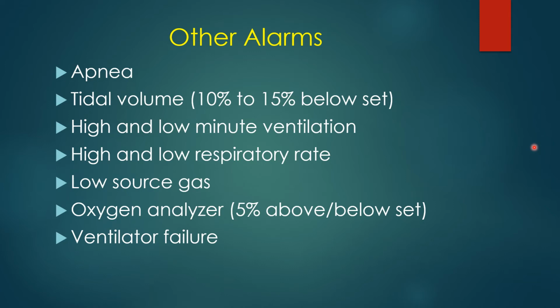The ventilators have an oxygen analyzer built in. The old ventilators didn't; you had to attach an oxygen analyzer. And the built-in oxygen analyzers tell you with an alarm if the analyzed O2 is off by 5%, above or below. And these ventilators today are very precise with the concentration of oxygen being delivered to the patient.